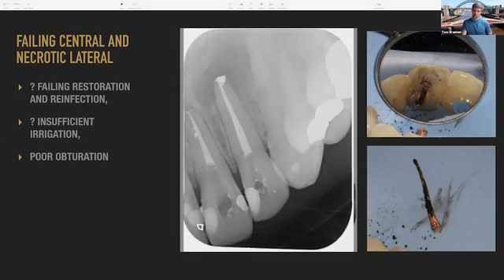And I think we left those, didn't completely seal the back of the teeth because he wanted to do some internal whitening because the teeth are darkened and discoloured over time. So that's why those obturations look a little bit low.